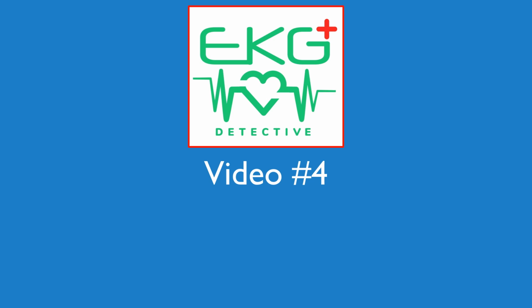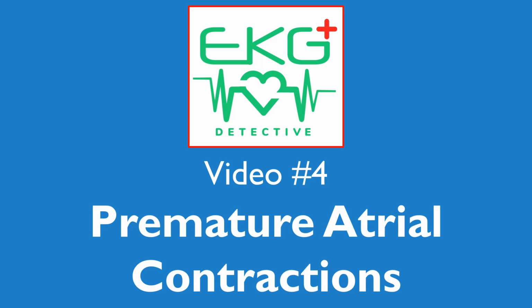Welcome back to video 4 of the EKG Detective. For this video, we will be looking at premature atrial contractions.